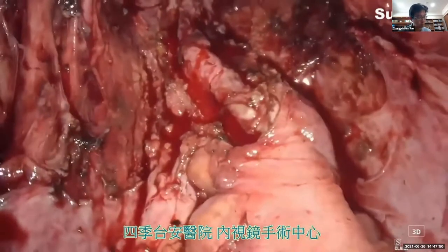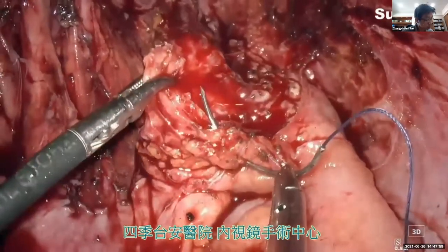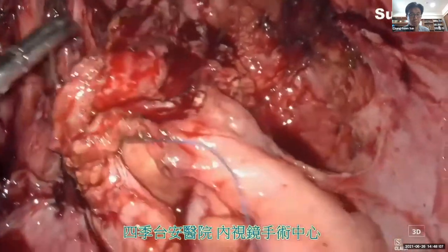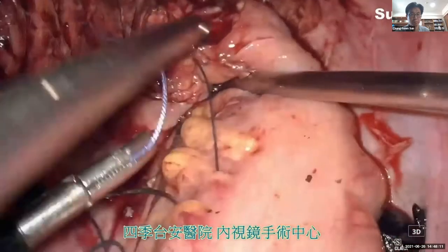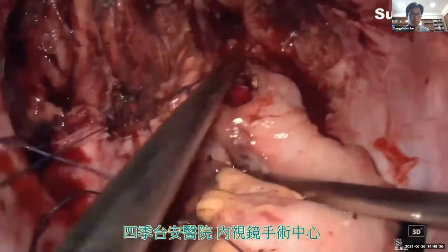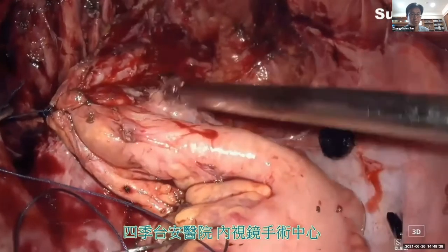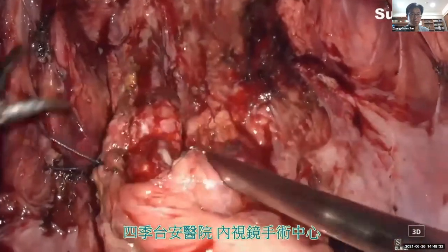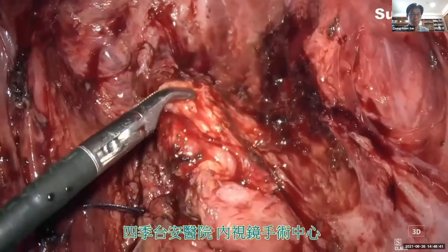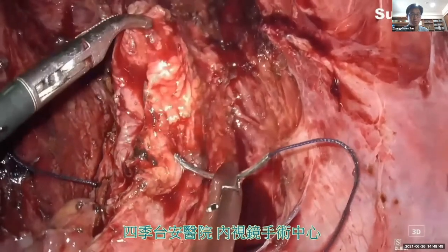Now we are going to close the muscular defect. We have to close the muscle defect transversely, otherwise we may induce rectal lumen narrowing. So we are now putting the stitches over the left angle of the muscle defect. This is the lower margin of the muscle defect. Now we are grasping on the right angle of the muscular defect. We make the suture of the right angle.